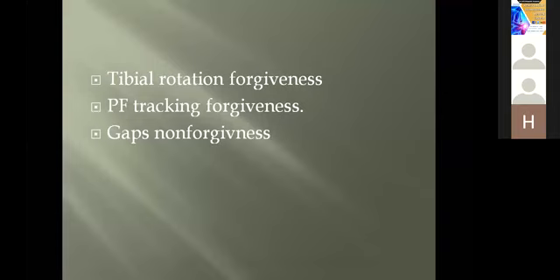The tibial rotation forgiveness. Many patients, especially in the Middle East and in Egypt, when you adjust the rotational design and the rotational position of the tibial implant, you are going into a dilemma, whether to adjust with the tibial tuberosity, or with the anterior shin of the tibia, or with the center of the ankle.